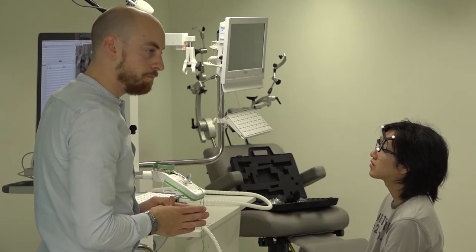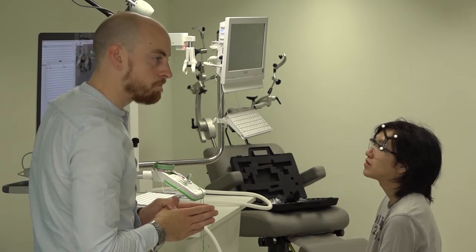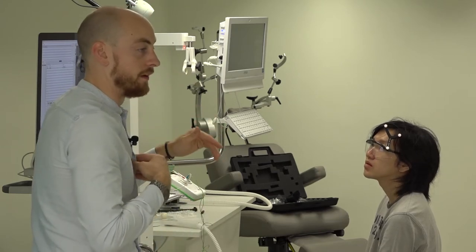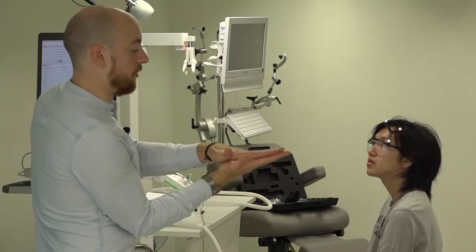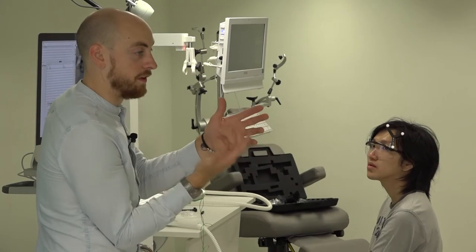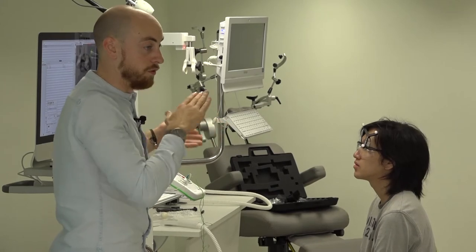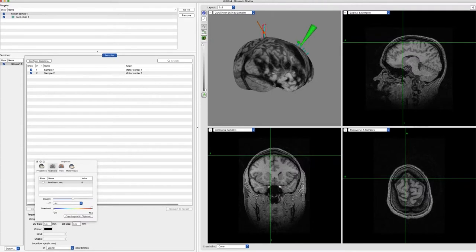Do we have to recalibrate the coil? Because the calibration you did was on the other coil and then you popped the... Yeah, so you'd want each coil to be calibrated. Okay. Yeah. So every time you administer TMS, you want to have calibrated the coil that you're using. So for example, if we're doing an rTMS protocol and we've got the two coils there, we want to calibrate each coil. So you could have BF71 and BF72. And then when you change coils on this, you could calibrate when you go down to whatever's driving it.